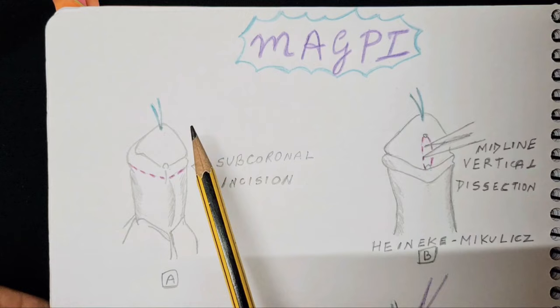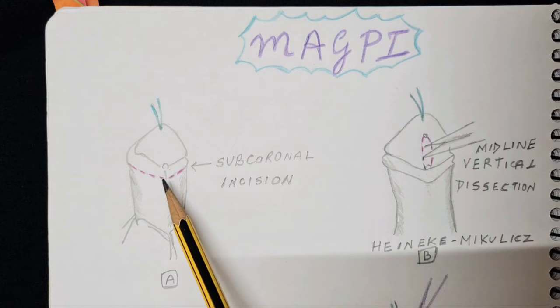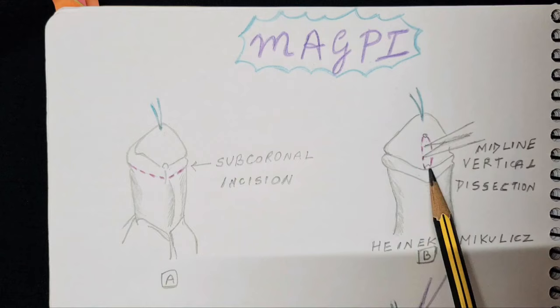For this technique, the first thing that has to be done is that a stay suture is taken at the distal-most tip of the glans. The first step is to do the degloving of the penile shaft by a subcoronal circumferential incision, which also helps to release the chordee.